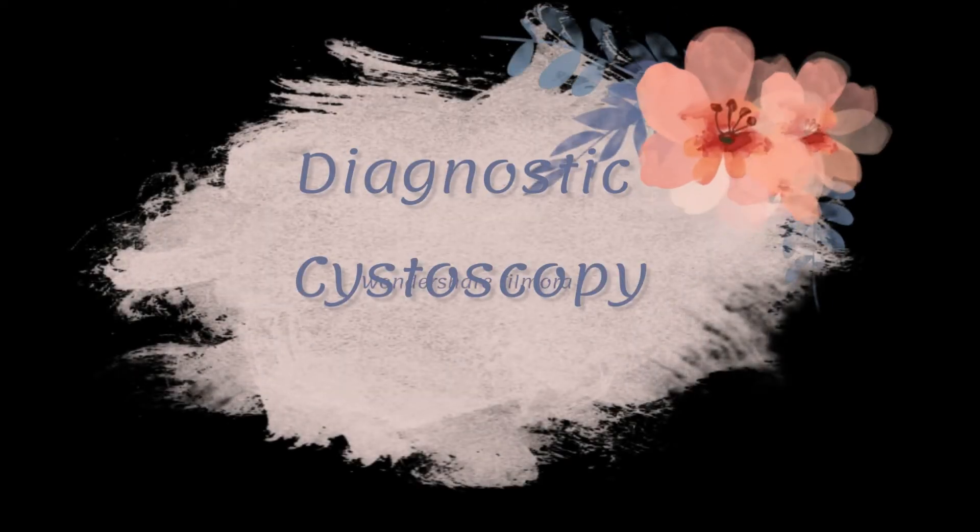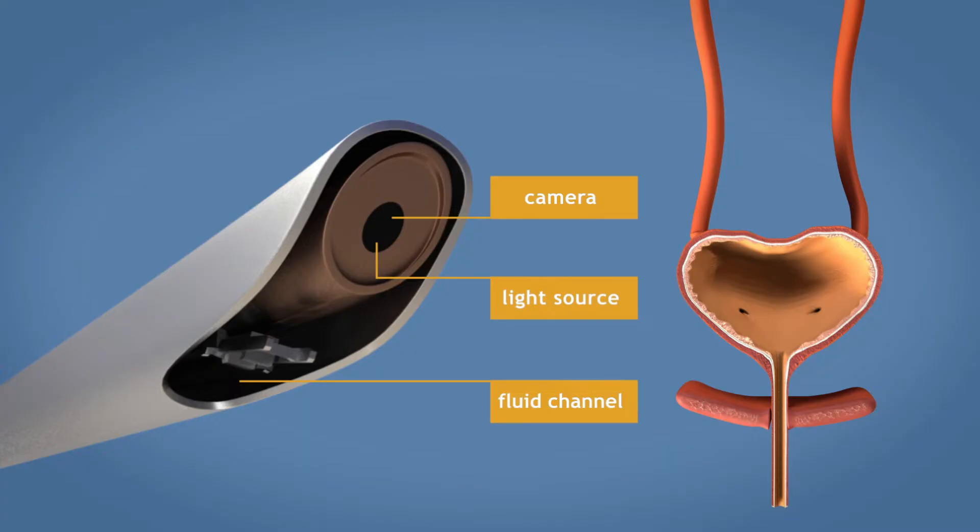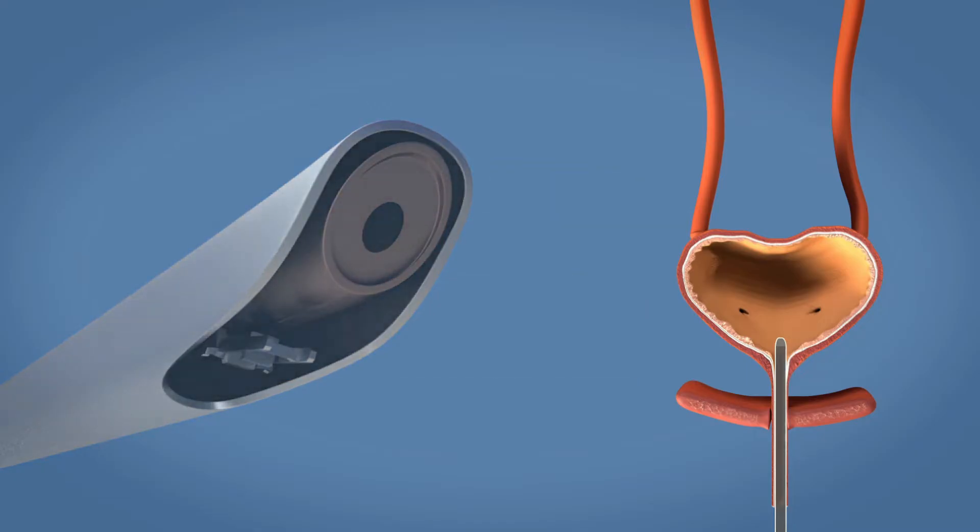Hello friends, today we are going to discuss the diagnostic cystoscopy and we will see how to perform it. It is performed with the 4mm 30-degree cystoscope with the cystoscopic sheath. The cystoscopic sheath is not completely circular — it is a little more in anteroposterior than in flatness, and it is introduced into the urethra, so it is of the proper shape of the urethra.